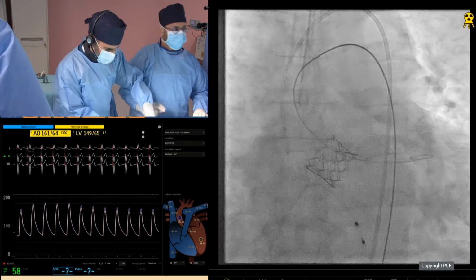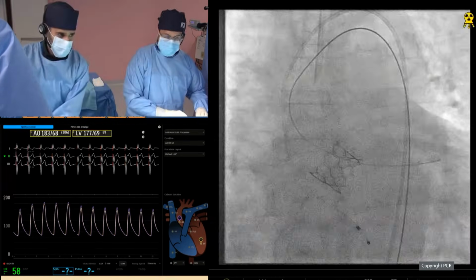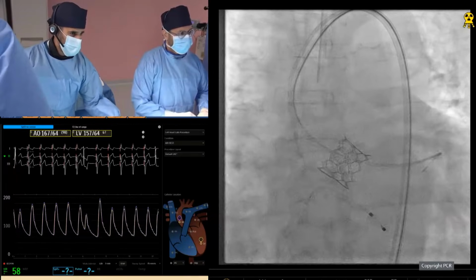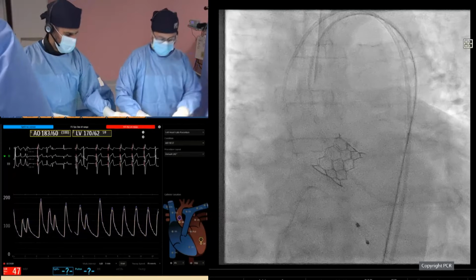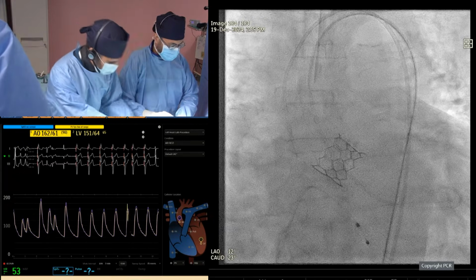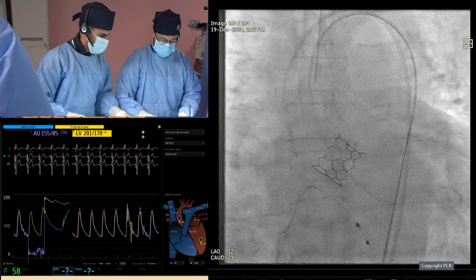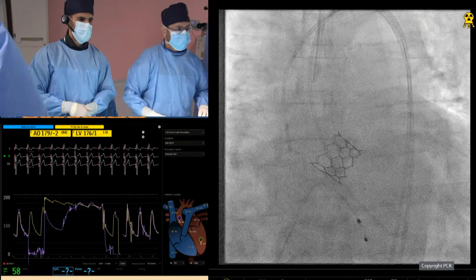Sure. So Nicholas, your preference, coplanar versus cusp overlap for shallow implants? Yeah, each time the right-left cusp overlap view is feasible regarding angles, I tend to implant the valves in that view, especially in that situation where you run 3D to target a high implant. But sometimes, as said, it's not even feasible. Yeah. So, Dr. Abdurrahman Mugheri, do you use the cusp overlap? You do a lot of balloon expandable?